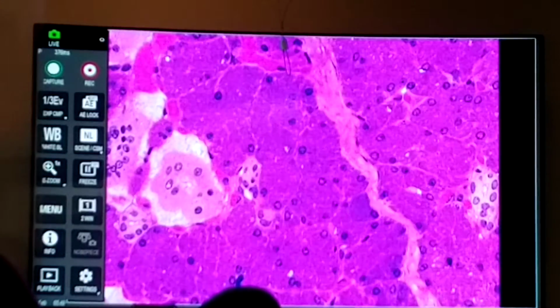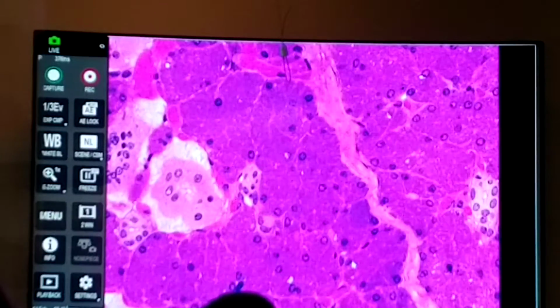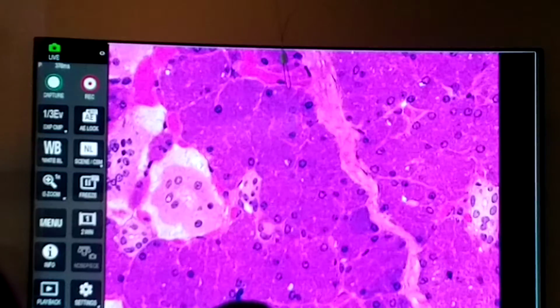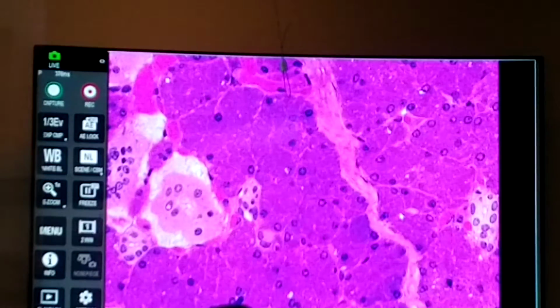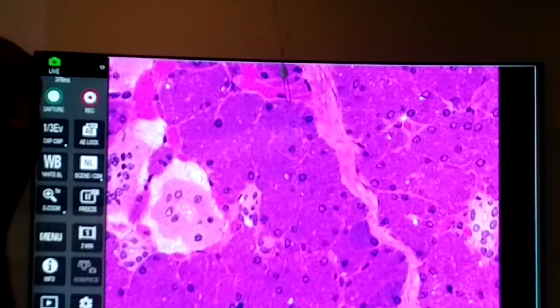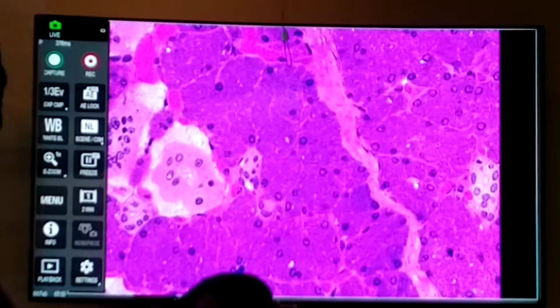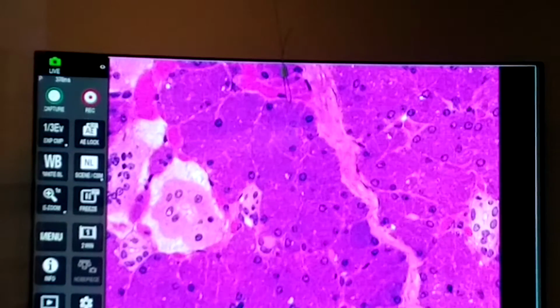So the parotid gland has lots of these little secretory units. Here's another one. But these are serous glands. They're darker staining, they have rounded nuclei, they have granules, they produce enzymes. Okay? These secretions that are carried by the lumen here are going to become part of saliva. They're going to contain an enzyme, salivary amylase, that will begin to break down carbohydrates.